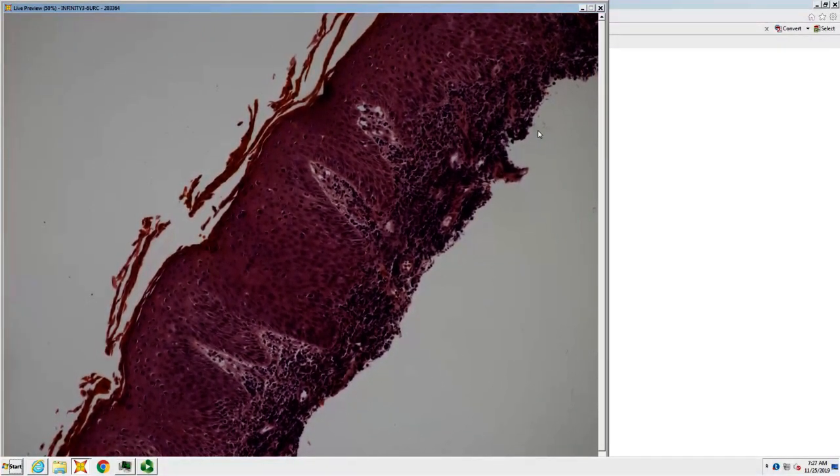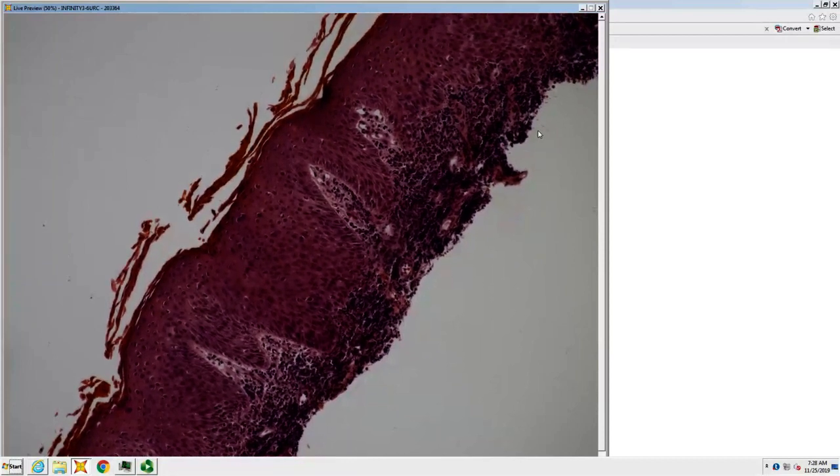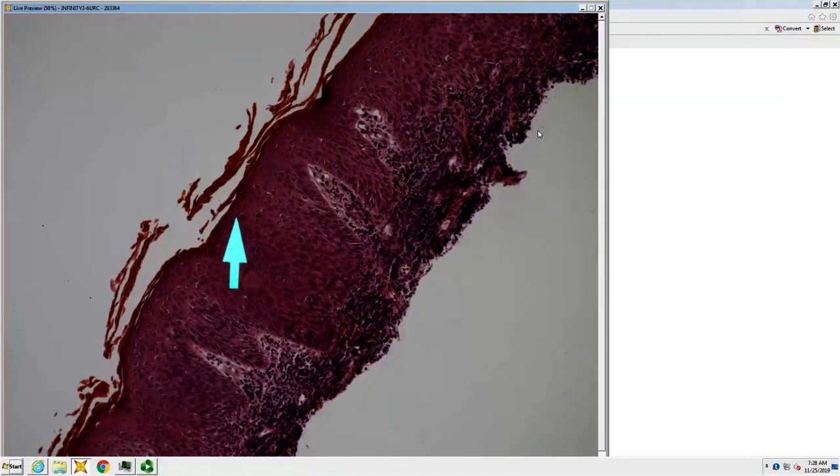Okay. If you do in situ hybridization, in low risk HPV, it's only in the coilocytes, and it's a single chromogenic. Often you use a blue chromogen, so a blue blob that sits out in the cytoplasm. Whereas in high risk HPV, it is a dot-like intranuclear pattern. So the pattern is very characteristic when you do in situ. And it's that incorporation into the genome that makes the high risk high risk.